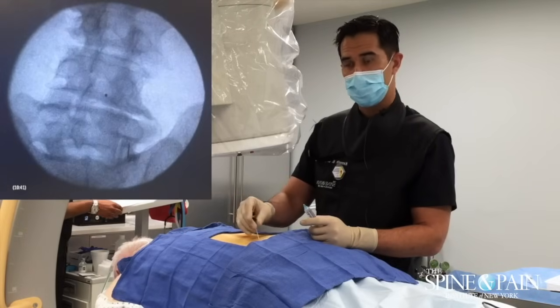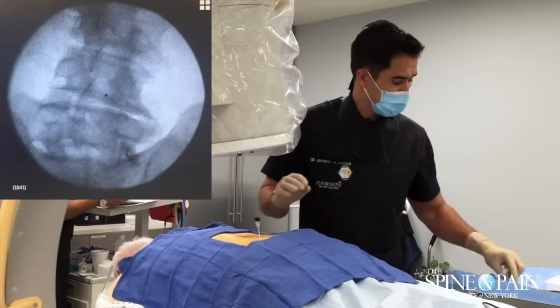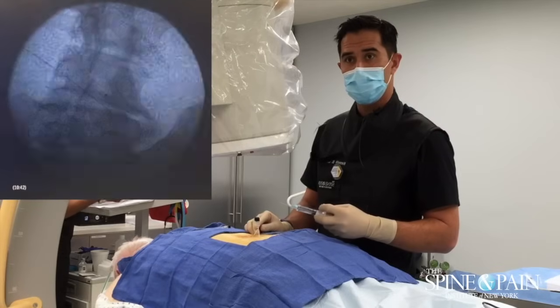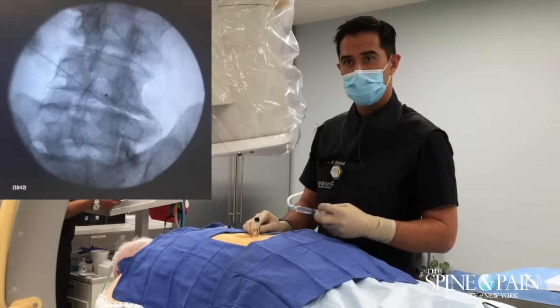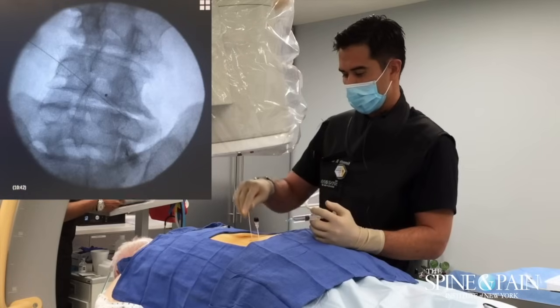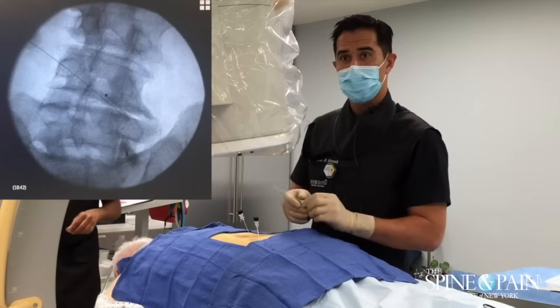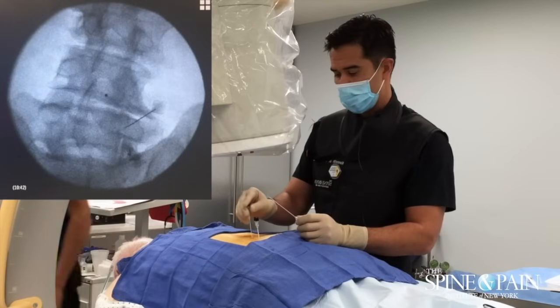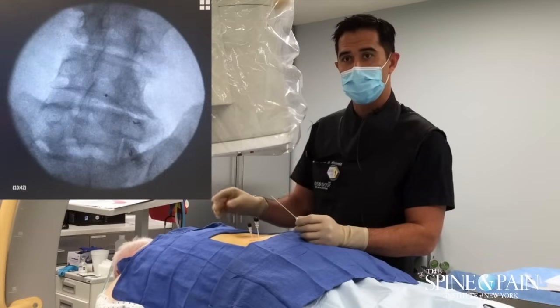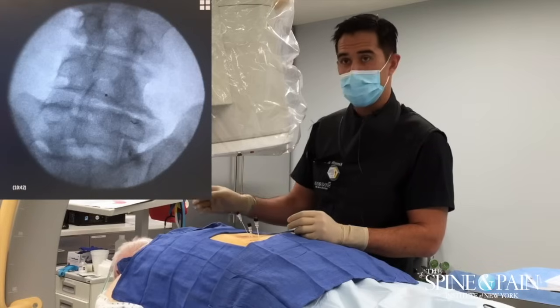We're going to go down there, touch bone, and then proceed. Our goal is to create a big lesion around the space in which the nerve — the interface of the facet joints — is going to lie.